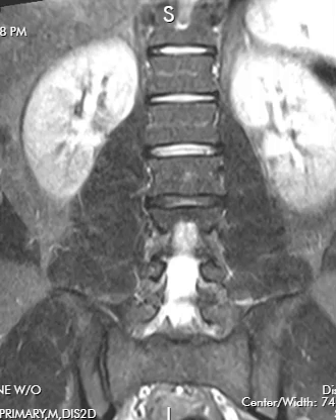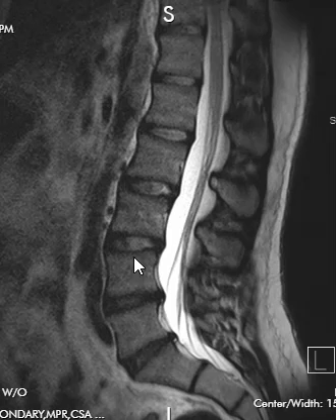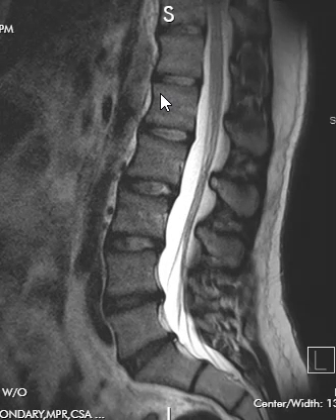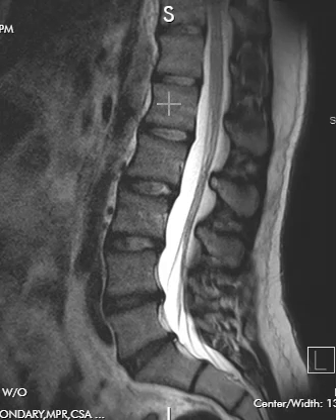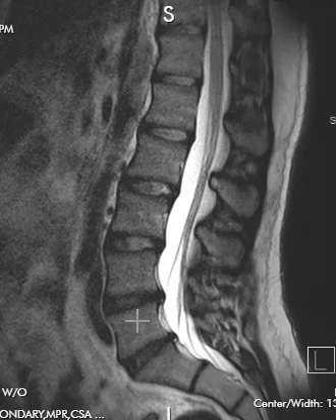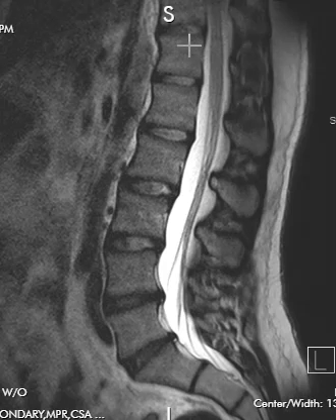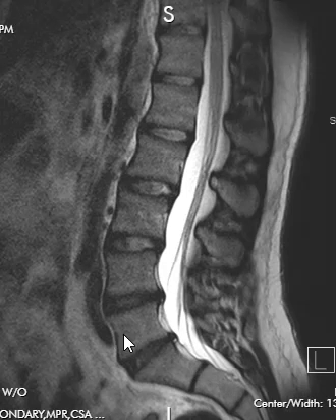Then we switch over to a side view called a sagittal view. On the sagittal view we can see the vertebral bodies in profile. This is the very back of the patient, this is the table they lay on, and this bright band is normal subcutaneous fat. These areas back here are called the spinous processes, and these are the vertebral bodies: L1, 2, 3, 4, 5 — so five lumbar vertebral bodies are present. Above the lumbar spine is the thoracic spine, and down below is the sacrum.